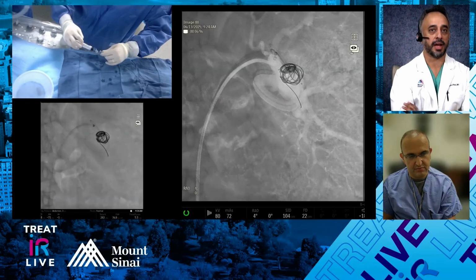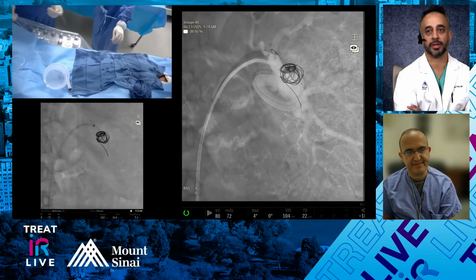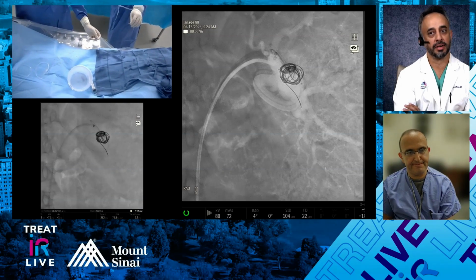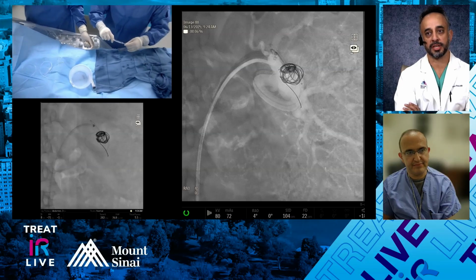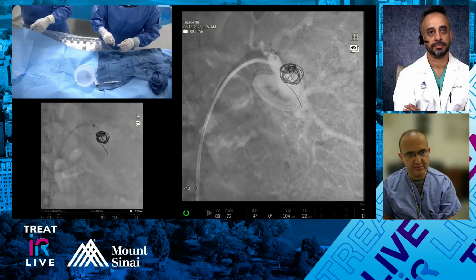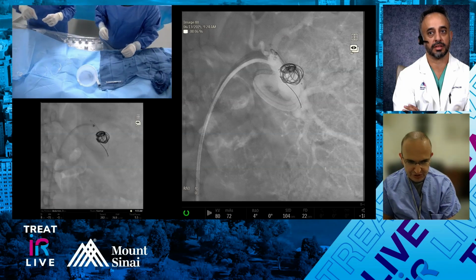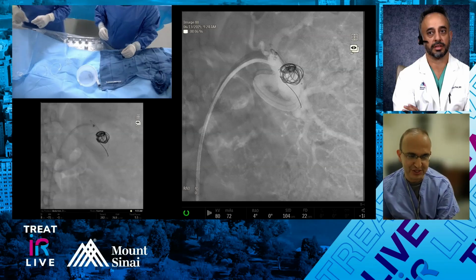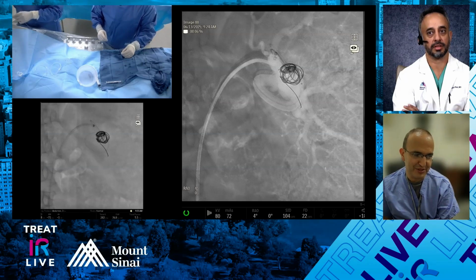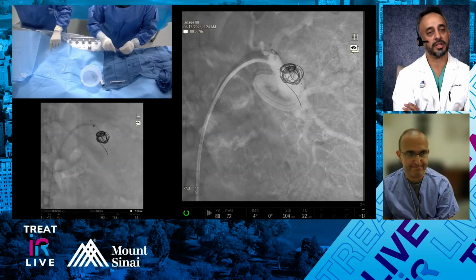In terms of microcatheter, as you said, your catheter is buried in there. I kind of like the dual marker catheter systems, because you may not need to know where your tip is, but at least you know where the detachment mechanism is going to come out, right? I would like to emphasize the nitinol wire is very useful because usually it's just the fellow, but if they're really aggressive about pushing it in, you bend that proximal part and it gets really hard to push the rest of the coil in through the catheter. Yeah, it kinks. Or you get premature detachment, right? Especially with some of the coils. Yeah, so it is nice.